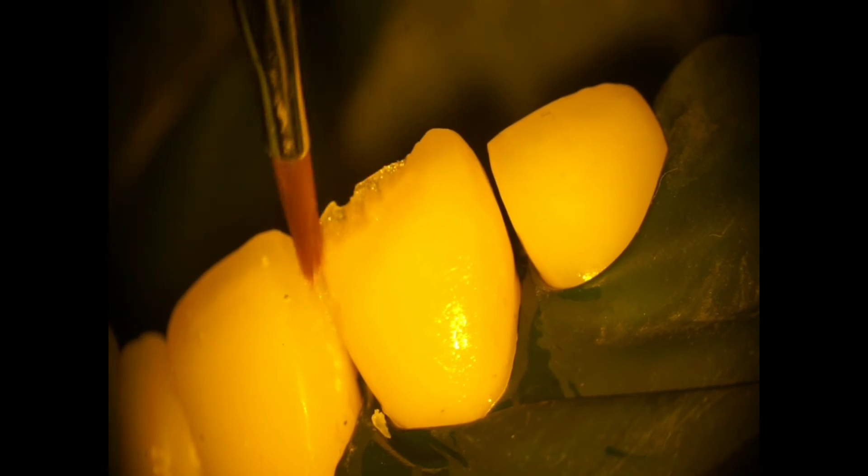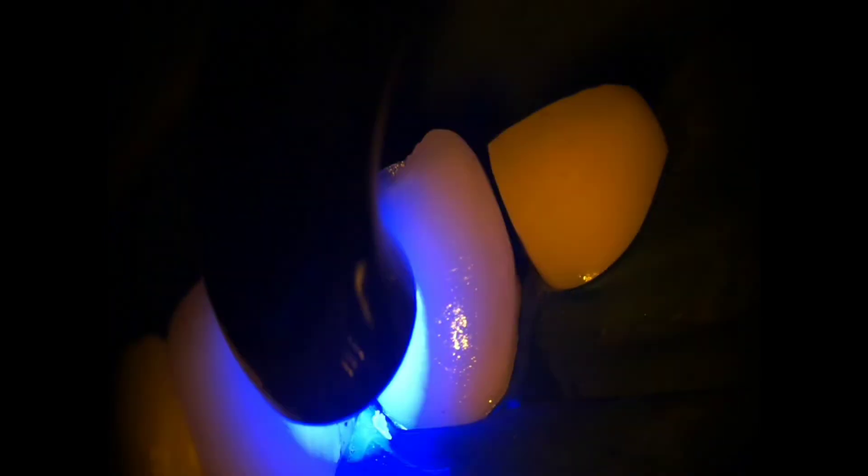Merge it with the tooth. See that your dentine composite will cross the broken part of the tooth and make some room for the incisal composite. Make the lobes with a thin instrument. Cure it.